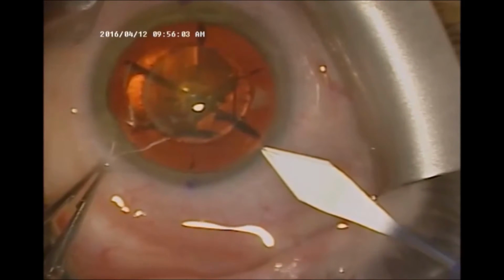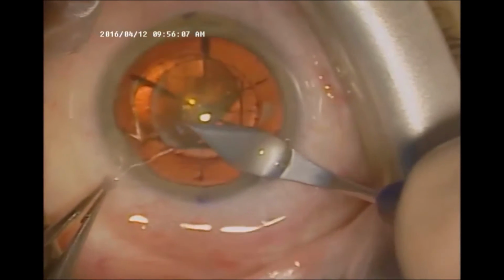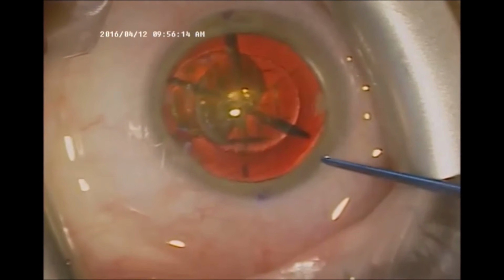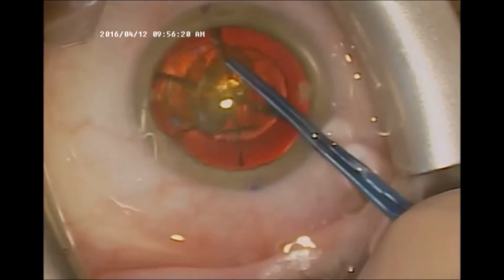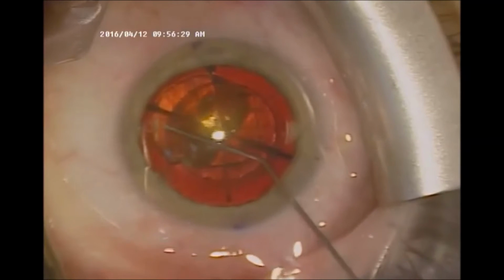Sometimes I use a blade, sometimes I don't. Here I use a blade to make the primary incision, widening only the inside of the wound. And here I use a forceps to remove the capsulotomy, or the front part of the capsule of the natural lens, which has been created by the femtosecond laser.